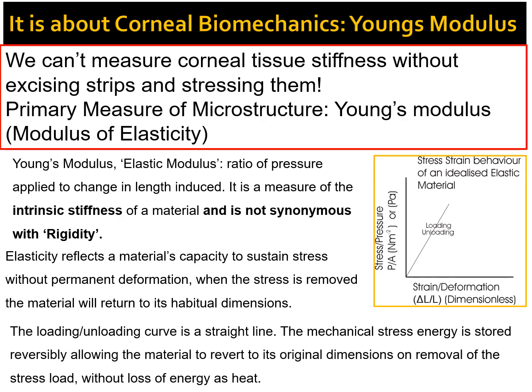And the elastic modulus is the ratio of pressure applied to the change in length induced. So it's a measure of the intrinsic stiffness of a material, and that is not synonymous with rigidity. And this is where a lot of the literature gets way confused, because they're being written by optometrists and ophthalmologists, not by people who understand biomechanics particularly well. And if you say something's rigid or stiff, it sounds like the same sort of thing. Well, they're not. Biomechanically, they're not.